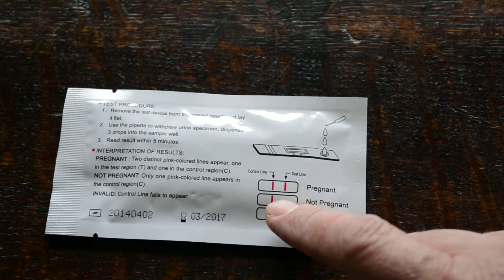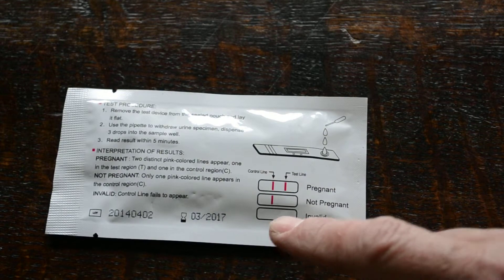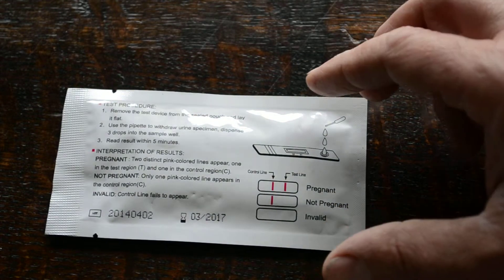If you're pregnant you get two lines — a nice clear test line. If you're not pregnant you just get a control line. If the test hasn't worked for some reason you get an invalid result — no control lines or test lines.